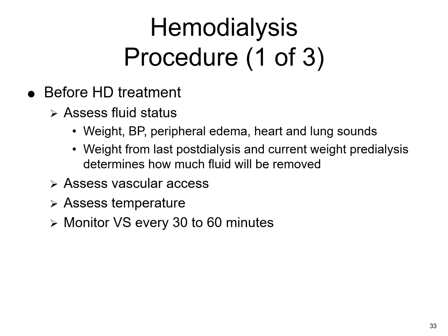Some of it is related to the pressures within the machine itself. So the nurses really have to know what they're doing. So these are specialized units. If you are on a floor that has a dialysis room, the patient can be dialyzed on the floor, but you will get the nurse that knows about hemodialysis, right? So the nurses are pretty much like ICU nurses, and they get special training because things can go bad very, very quickly with this as well. And I think you can understand why.